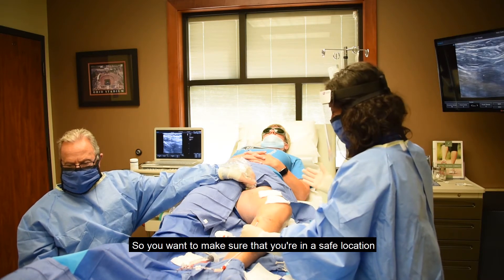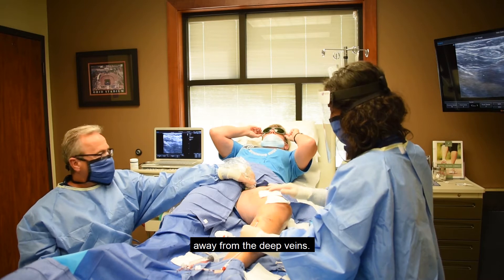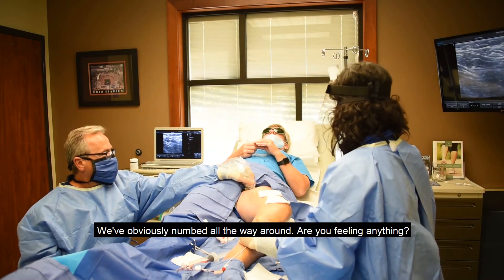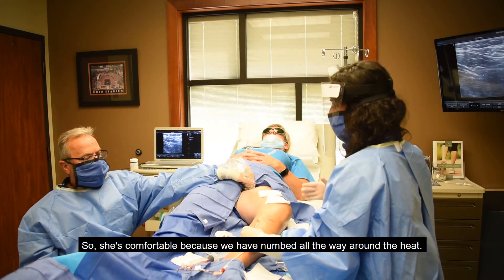We've obviously numbed all the way around. Are you feeling anything? Good — she's comfortable because we've numbed all the way around the vein.